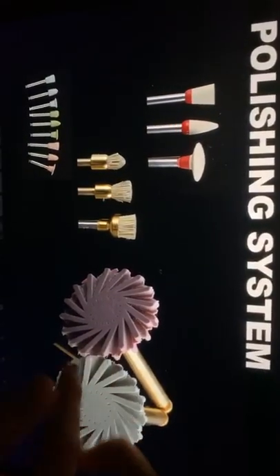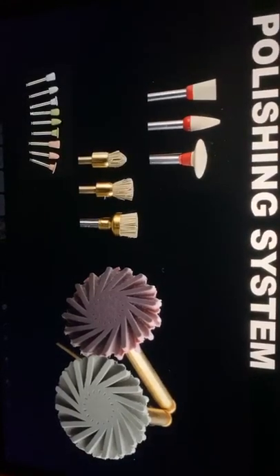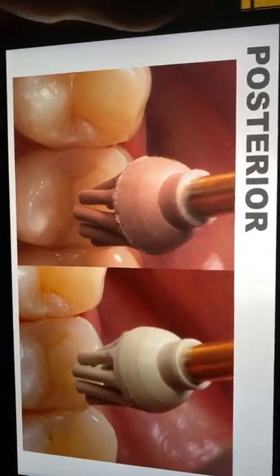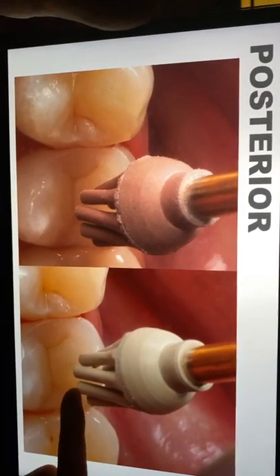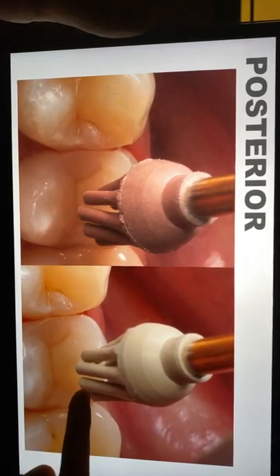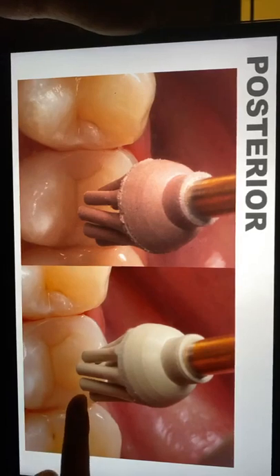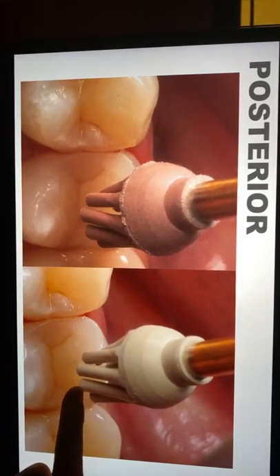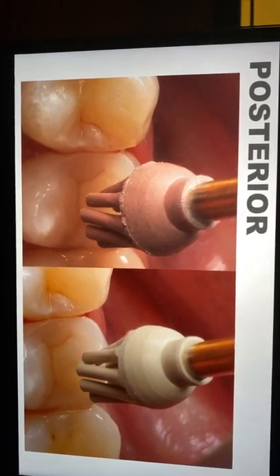So this is called the Dicomp Twist, but actually this one is for the anterior. I have a very specific one for posterior, and I really like the instrument a lot. This one is the Dicomp from Germany, the name is Occlusflex. It can go very deep into your fissures, so that it will polish all the surface. If you notice the previous twist, the round form will be harder to reach the very deep fissures that you create. But this one is very specific, so you can enter all the very deep fissures, so that all the surface can be polished very well.